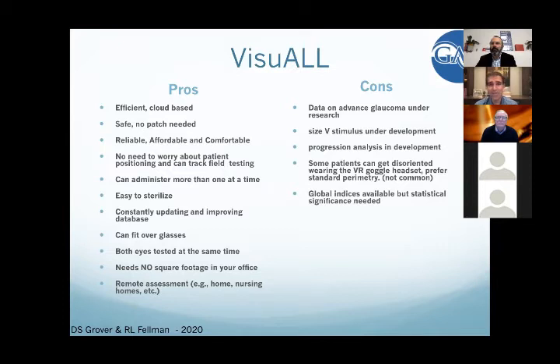I mean, it's still a visual field, right? So when I'm talking to my patients and saying, you did the Humphrey test, and then you've done this one, which one do you prefer? They're like, oh, we don't like any test. I was like, okay, well, if you had to choose, what would you choose? And a lot of them are really happy with this technology and this interface.